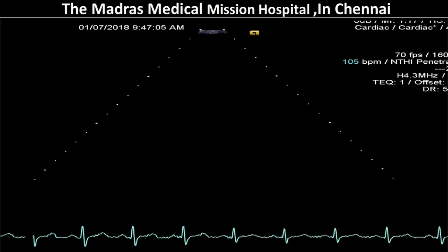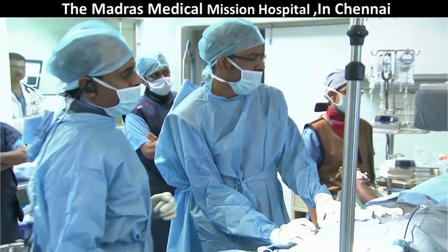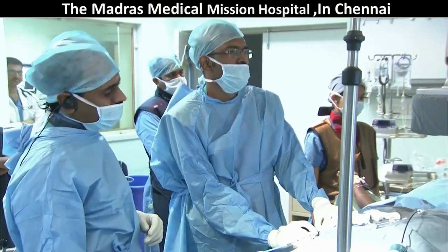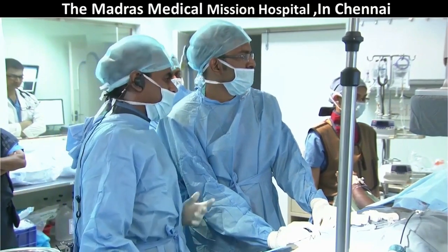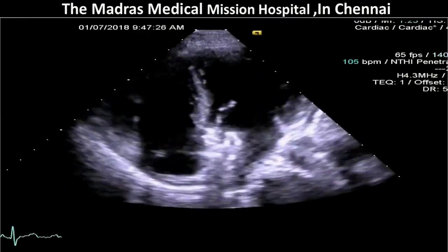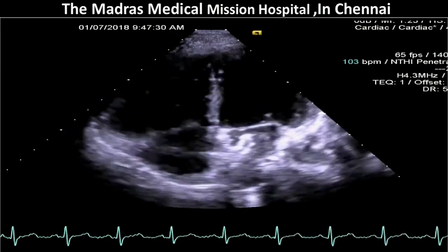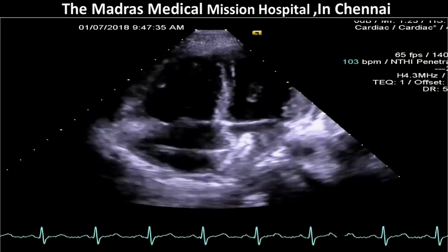In the US, Canada and all, where the anesthesia is very, very expensive, they try to always use an intracardiac echo, because if the cath lab interventionist is doing the procedure alone with his own imaging gadgets, then it makes it very simple. So this is the conventional transthoracic echo probe. Yeah, it's looking good here.